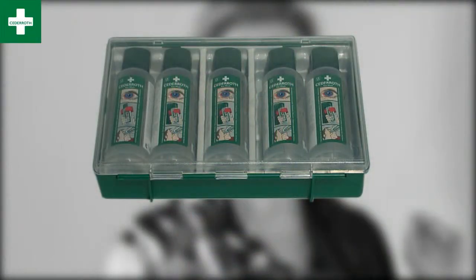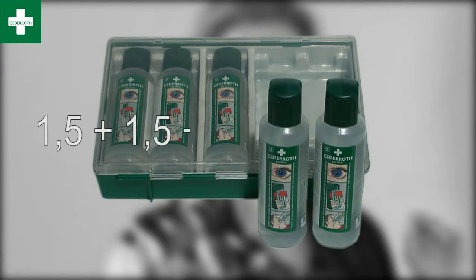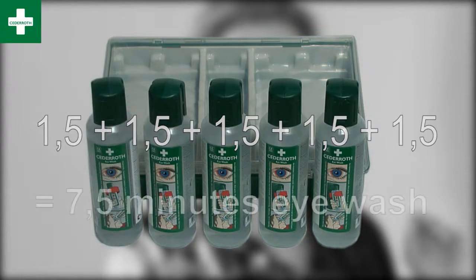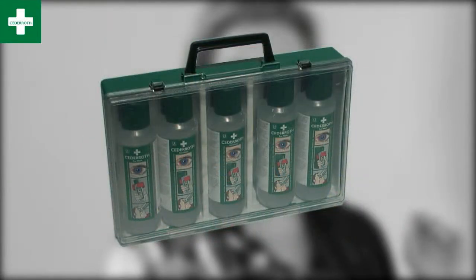Even though two flushing bottles can't replace a proper eye shower, you'll do quite well if you also have Cedaroth's five-pack case. Each bottle provides about one and a half minutes of flushing, giving you about seven minutes of flushing capacity in one case. You now have a good chance of getting the eye clean.